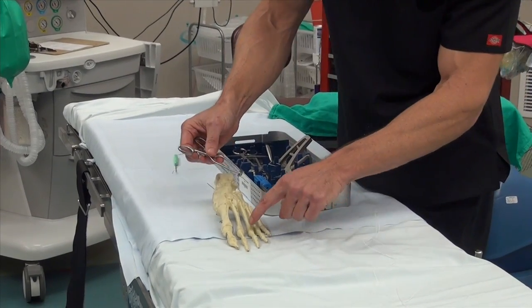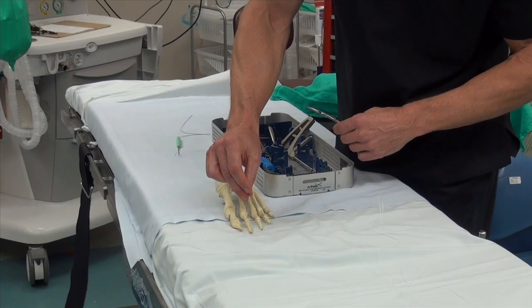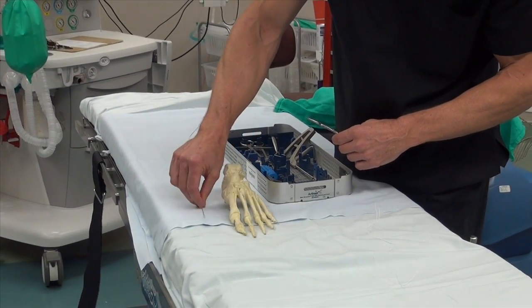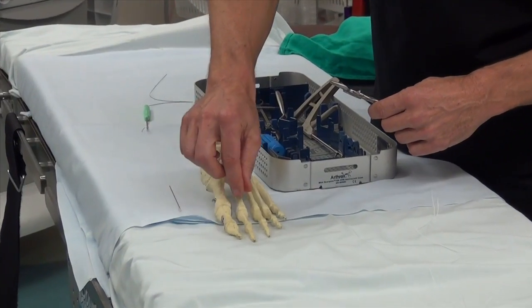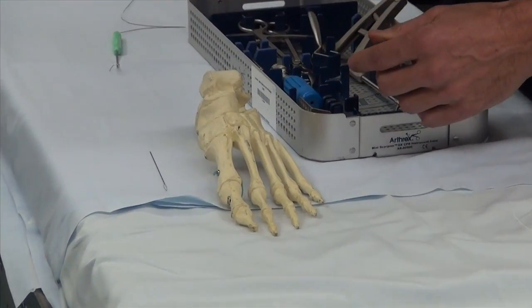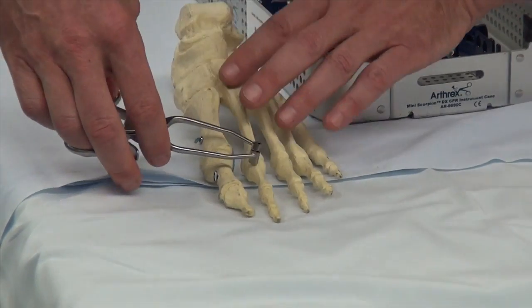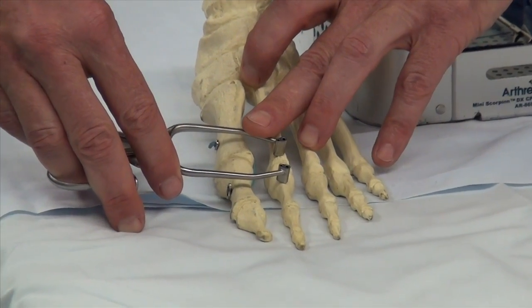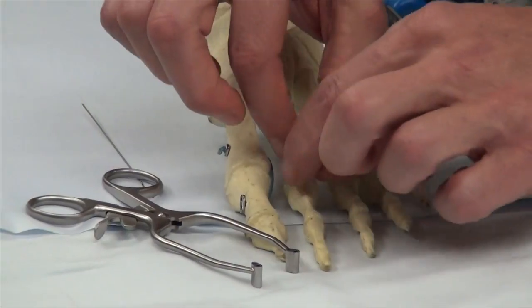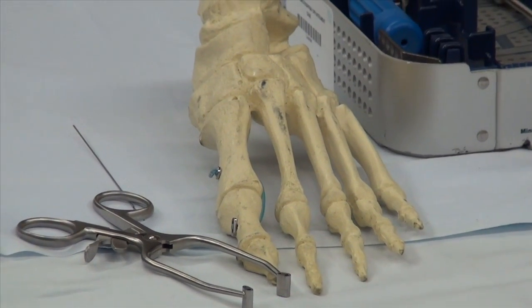This is the distractor. If I drill a pin here in the head and a pin here at the toe, getting into this joint to fix the plate below — the soft tissue down here that holds the toe downward — is very hard. We slide this device over the wires and tighten up here, clamping and spreading it to open the toe so I can get in there.